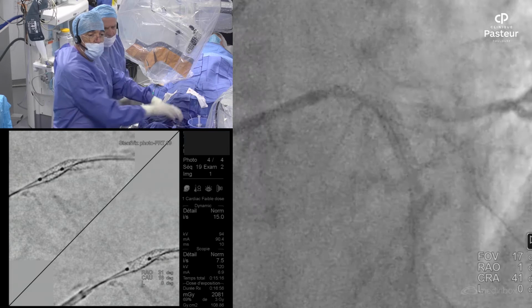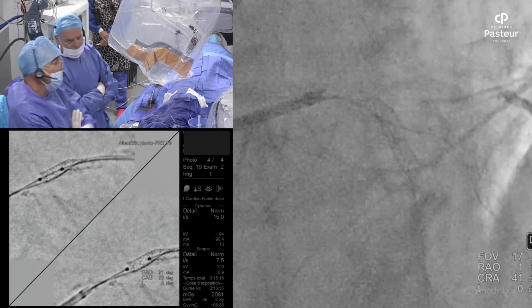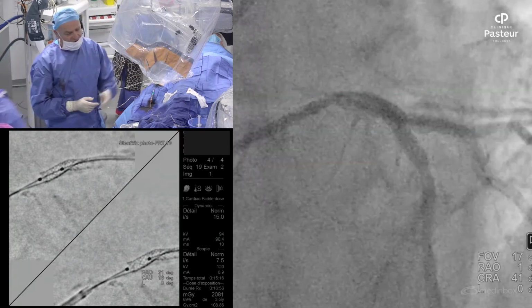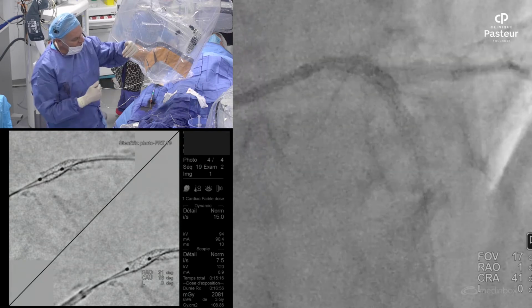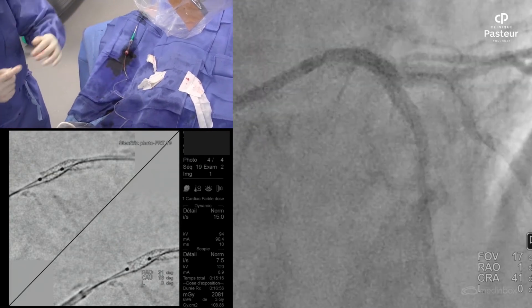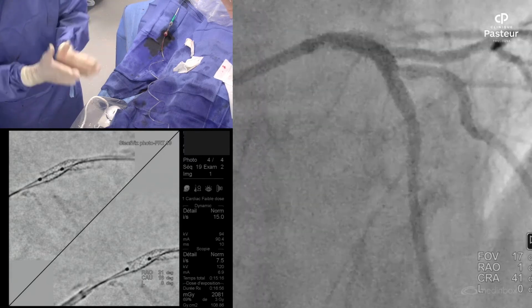Could you please explain about the bend at the wire tip for rewiring? Is a single bend okay, or do you need two bends? In general, I put two bends, and I think it depends on the diameter of the artery. When you have a quite large artery like 3.5 or 4.0, you probably need two bends, quite large, because to cross toward the struts you sometimes need some push from the opposite wall, so you need to anticipate the length of the wire from the opposite wall to the struts. That's why sometimes you need a quite large bend.